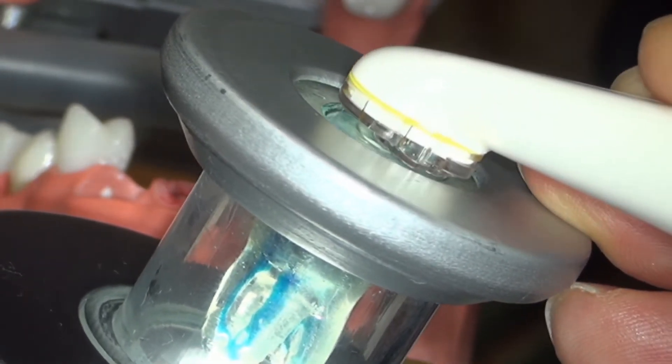Okay, so now we're introducing the Gentle Wave in. We're zooming in a little bit. Where's the, oh, you've got your foot pedal right there.